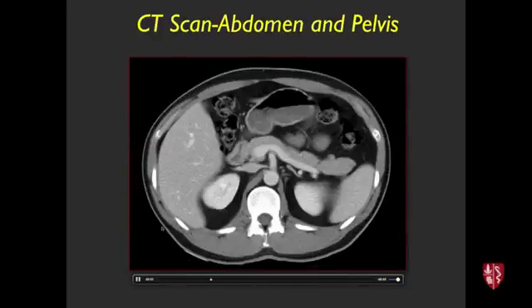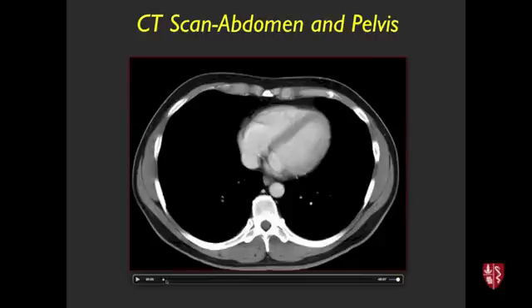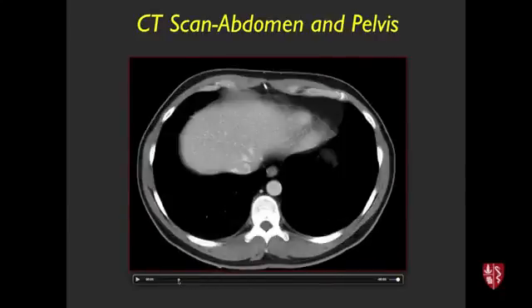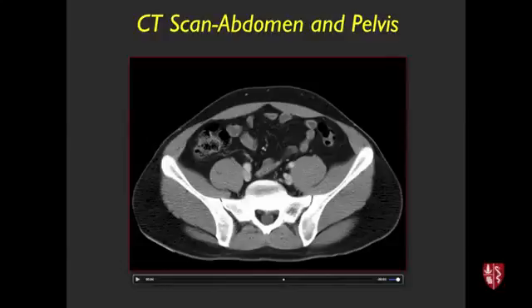You'd have to do like 50 slices, so there's misregistration between the slices. Nowadays we have helical CT, for the last 20 years or so. One breath hold, take a breath and hold it, bzzz, all the way down. That influences things like the timing of the intravenous contrast injection. That's outside the realm of this talk, but it's basically amazing how cool CT is now and how much it's evolved.